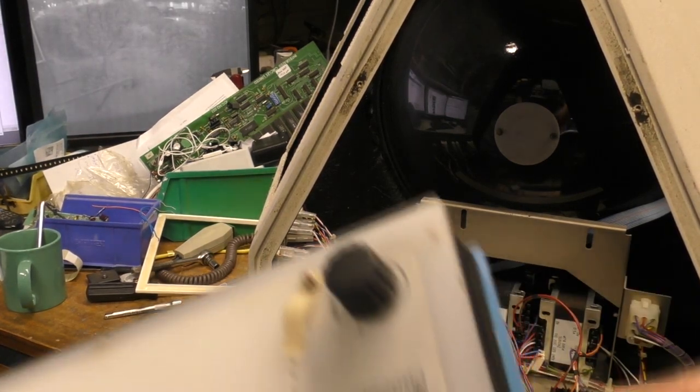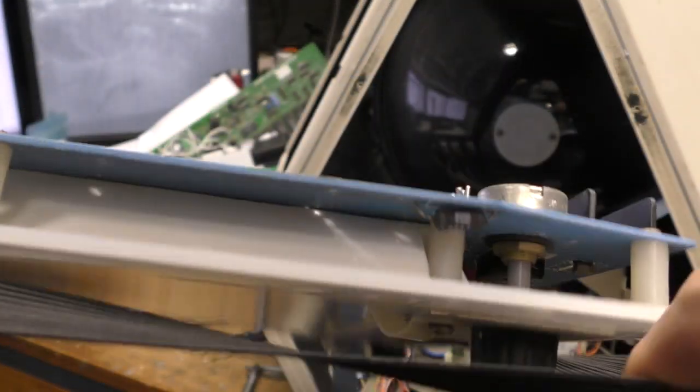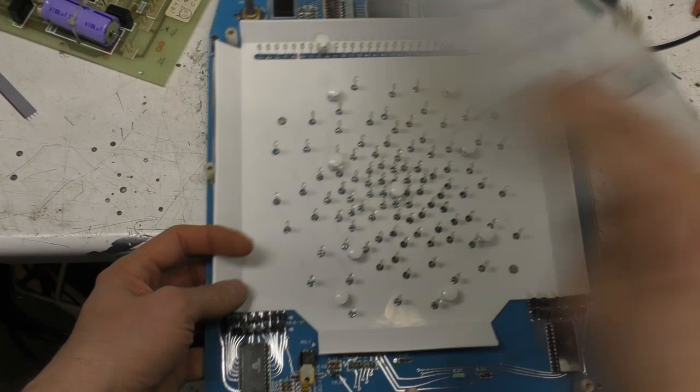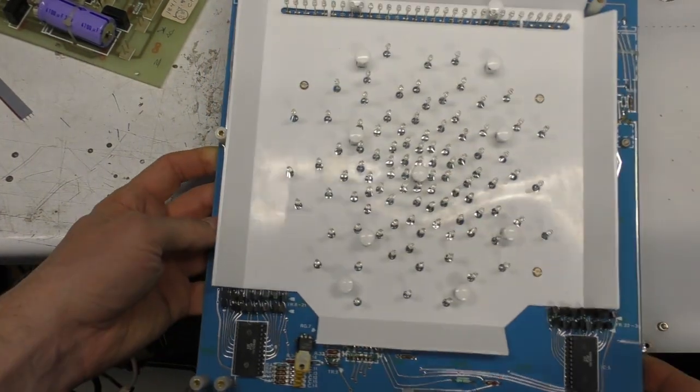Okay, so we had the Velcro holding the front panel on. Now we've got this piece of elastic. I think this must be designed as a light barrier to stop the strobe appearing on the front. There's a bit of elastic holding that light guide. Really weird. So this is the front panel PCB, as expected, just a bunch of LEDs.